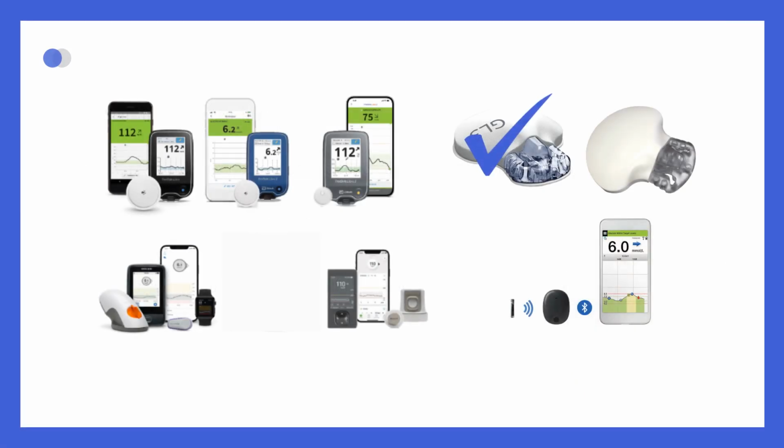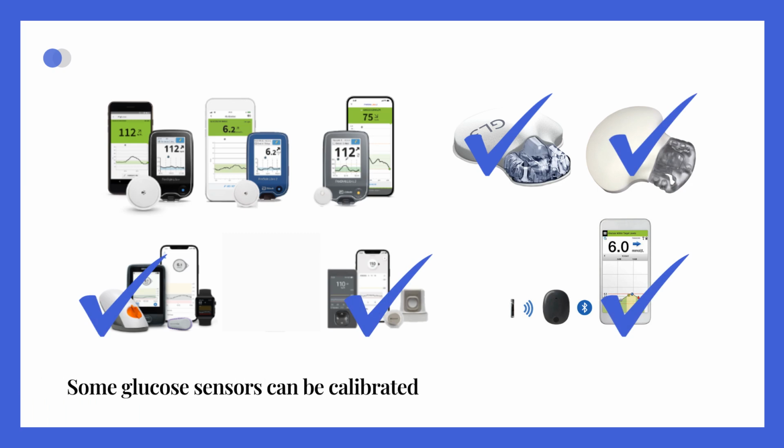In case your sensor continually demonstrates more than 20% difference from finger prick readings under stable and target range glucose conditions, consider calibrating it if it supports this feature, or replacing it with a new sensor. When contacted, most companies will typically provide a replacement sensor free of charge.